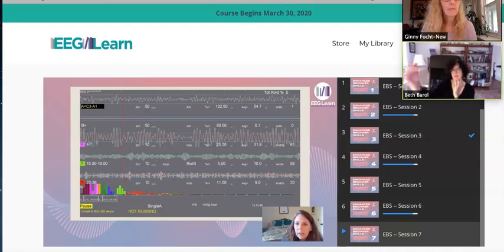They gave us those fixed... Well, and so she said that the inhibit bands, the percentages, we should change those in the auto goals to 35, 65, and 25, because she said what's defaulted there was actually set for people that have ADD, and that to make it more realistic, it should start with these percentages.